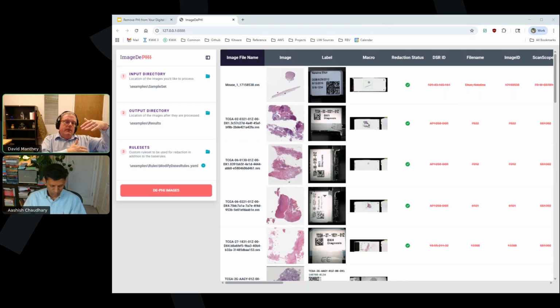In this case, for TIFF, we're using the Python library called tifftools, and that writes that data and is very pedantically correct. This is guaranteed to be a correct TIFF file that meets all these criteria. You'll see TIFF files with all sorts of minor petty issues; they're still readable, but they're not technically conformant. We're guaranteeing that we write conformant files, whether they're SVS or DICOM or TIFF.